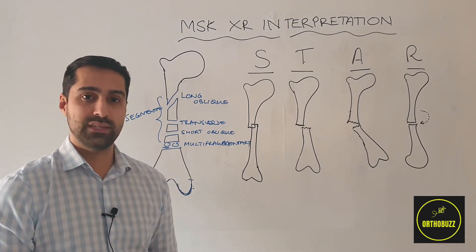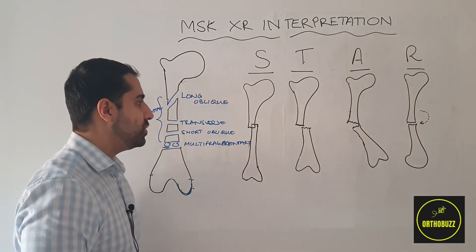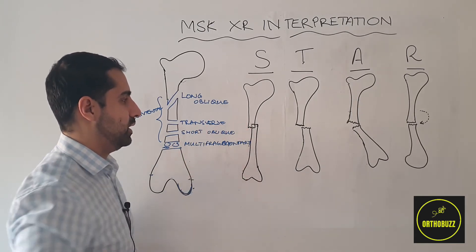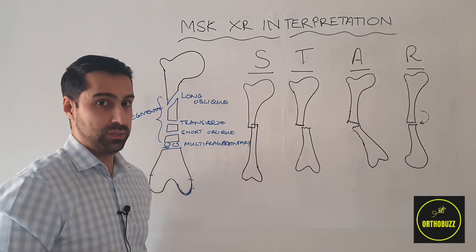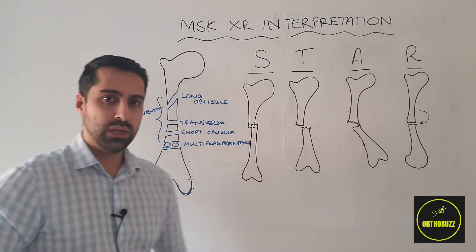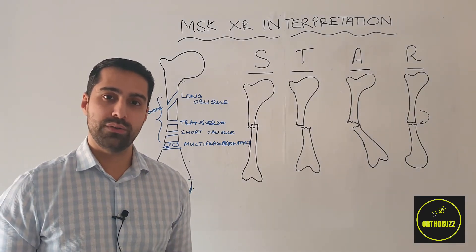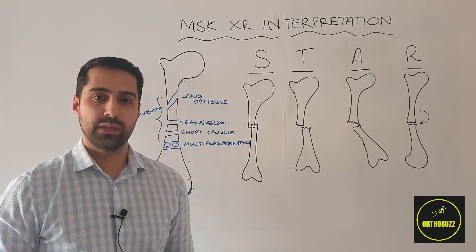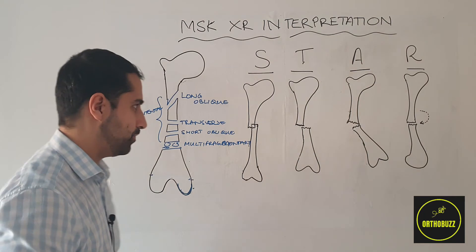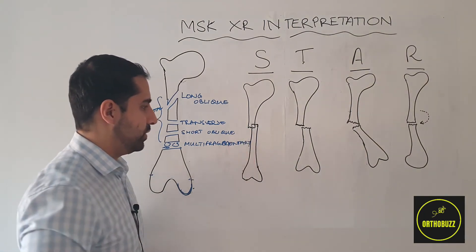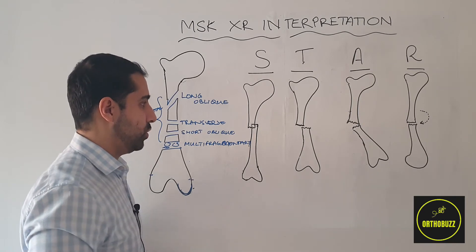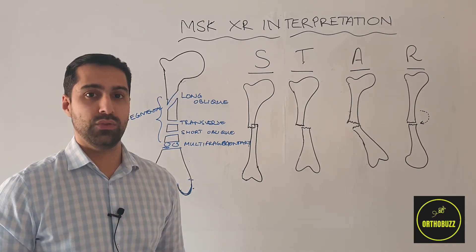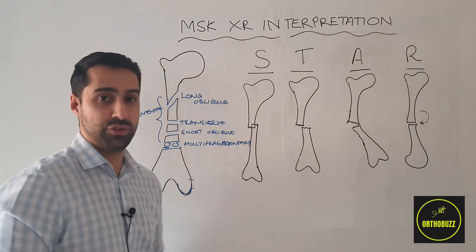Here we have a mid-diaphyseal transverse fracture where the two ends of the bones are shortened — the overall length of the bone is reduced. This is most often the case because muscles crossing the fracture contract, causing shortening of the bone ends. You can see this as overlapping on the x-ray and an overall reduction in the length of the bone. This can be described as mild, moderate, or severe shortening.